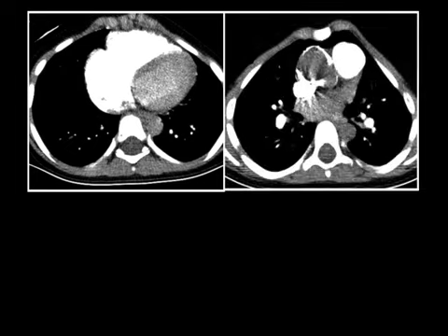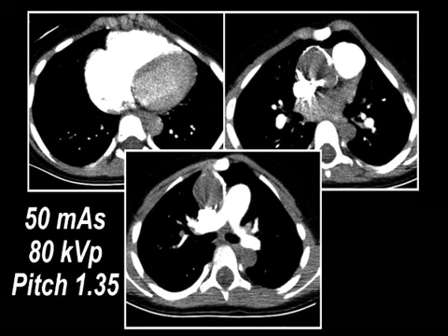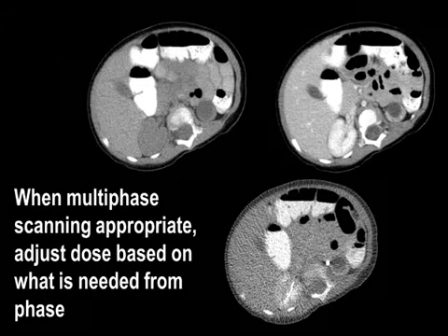Here's an example of chest CT. Right side of the heart is opacified. We're looking at the pulmonary arteries. Nice pulmonary arteriogram here. Very low mA, very low kVp. Again, this is in the order of dozens of chest x-rays rather than hundreds in terms of what we're able to see by taking advantage of lowering the kVp in children.